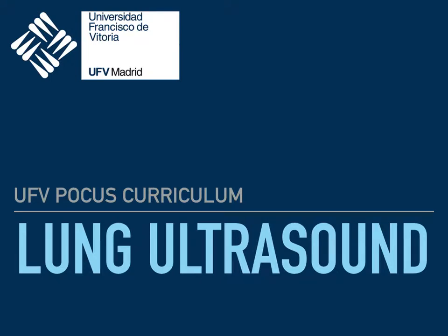Hello everyone, welcome to the Lung Ultrasound seminar. We are going to get an overview of basic lung ultrasound features and not so basic applications of lung ultrasound.